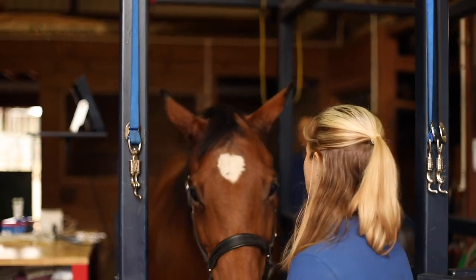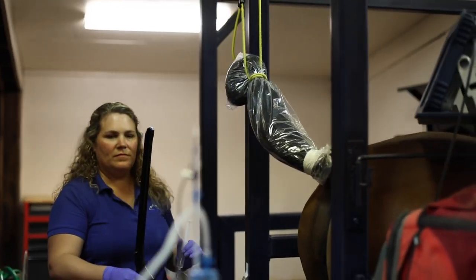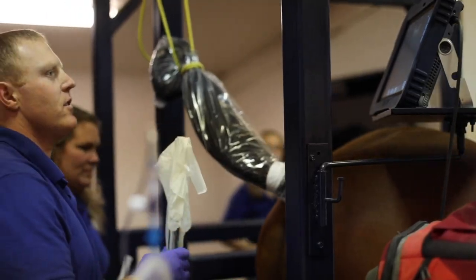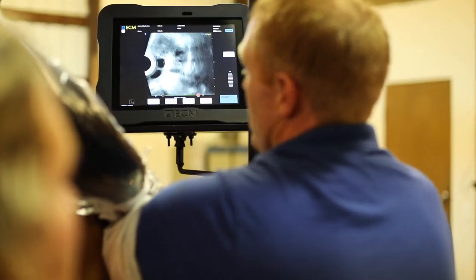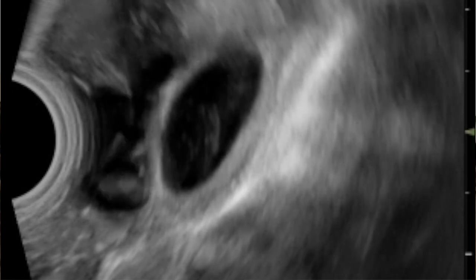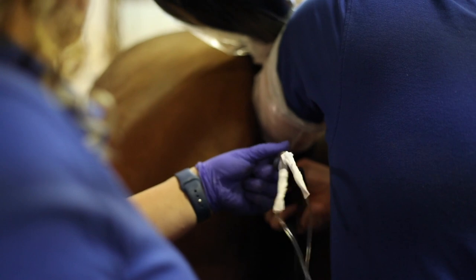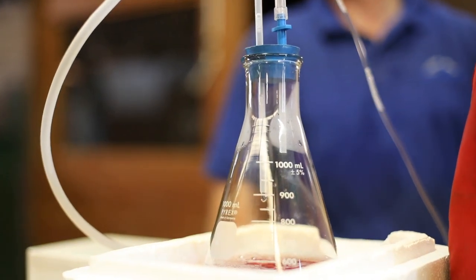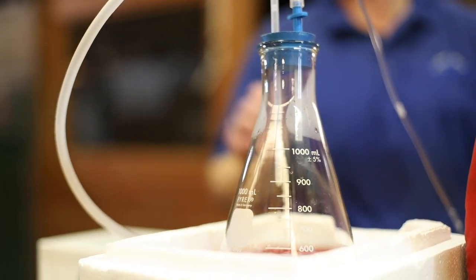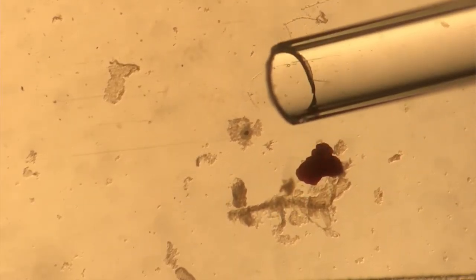For oocyte aspiration, we sedate the mare much like you would for joint injections. We then place an ultrasound probe in the vaginal vault of the mare and bring the ovary against the vaginal wall. We can then visualize the individual follicles on ultrasound and place a needle inside of each one of these follicles. We both aspirate and inject fluid at the same time. This allows us to wash the follicle completely. The main thing we need to do in the horse as compared to cattle is really scrape the wall of that follicle to remove the oocyte in its bed of cumulus cells away from the follicular wall and allow us to recover that individual oocyte.